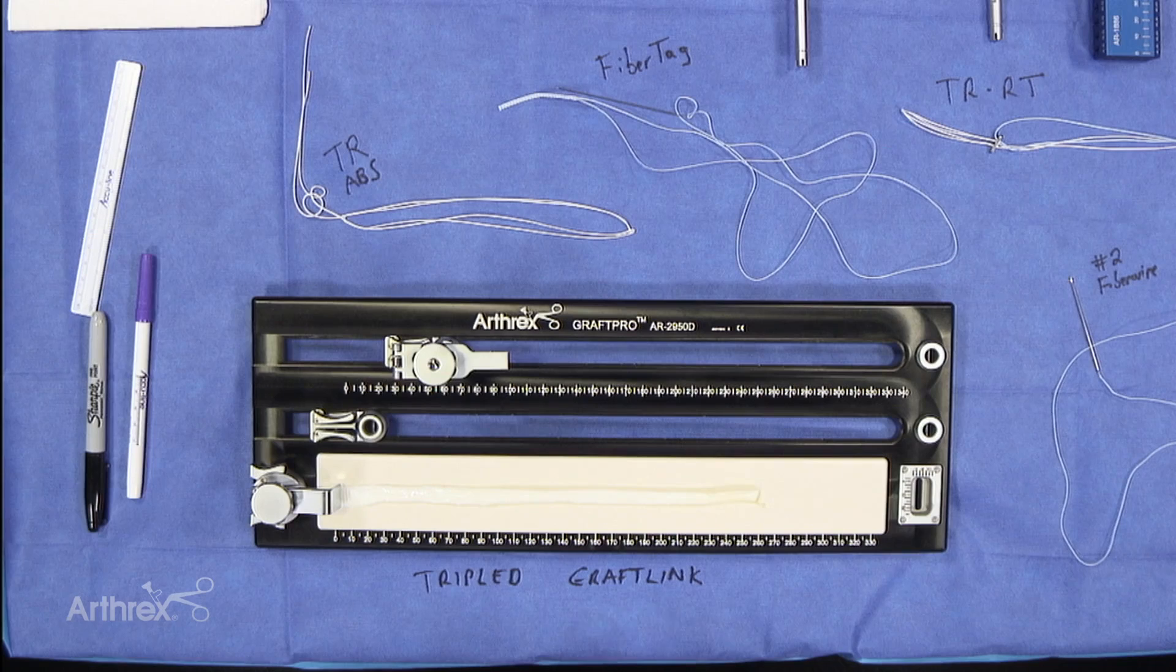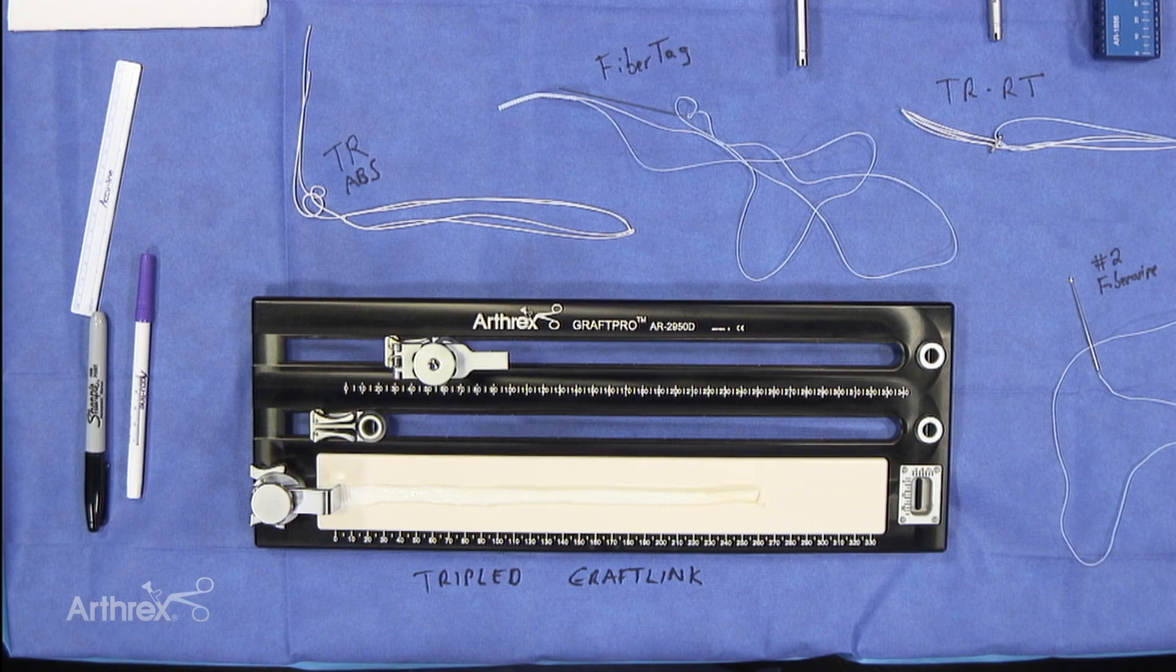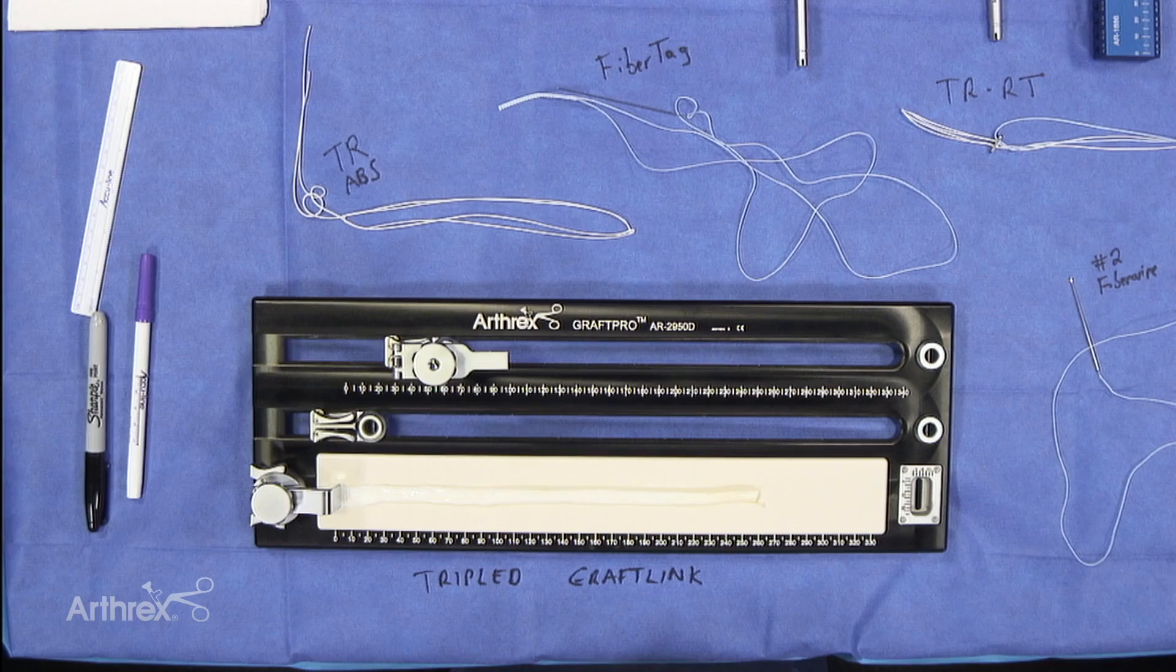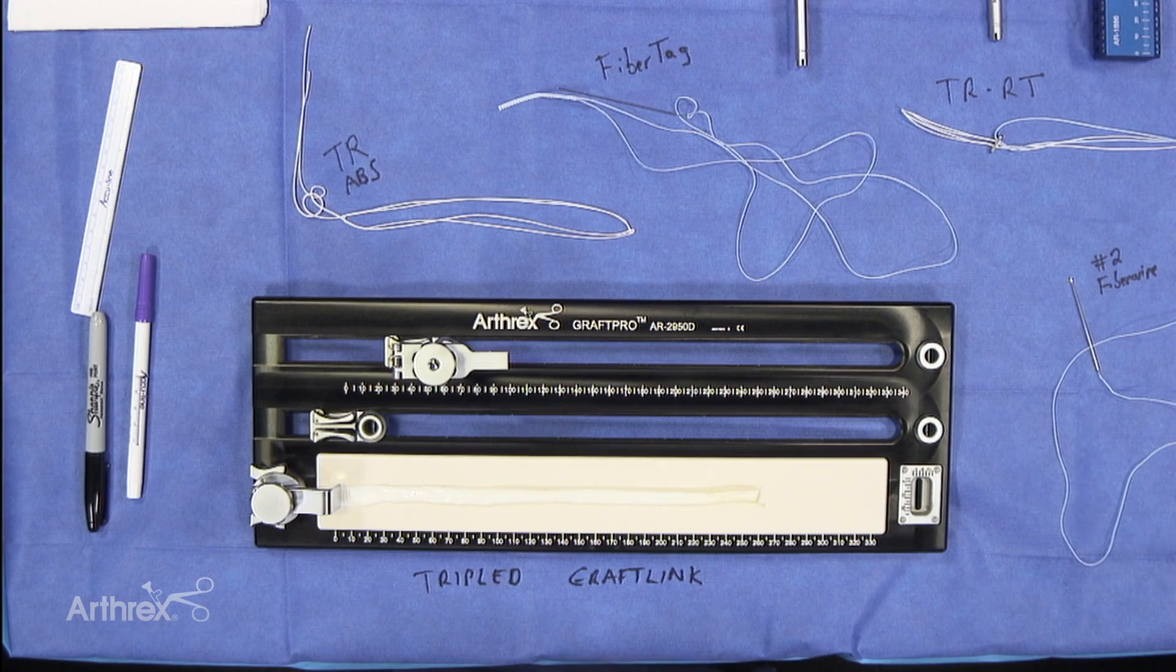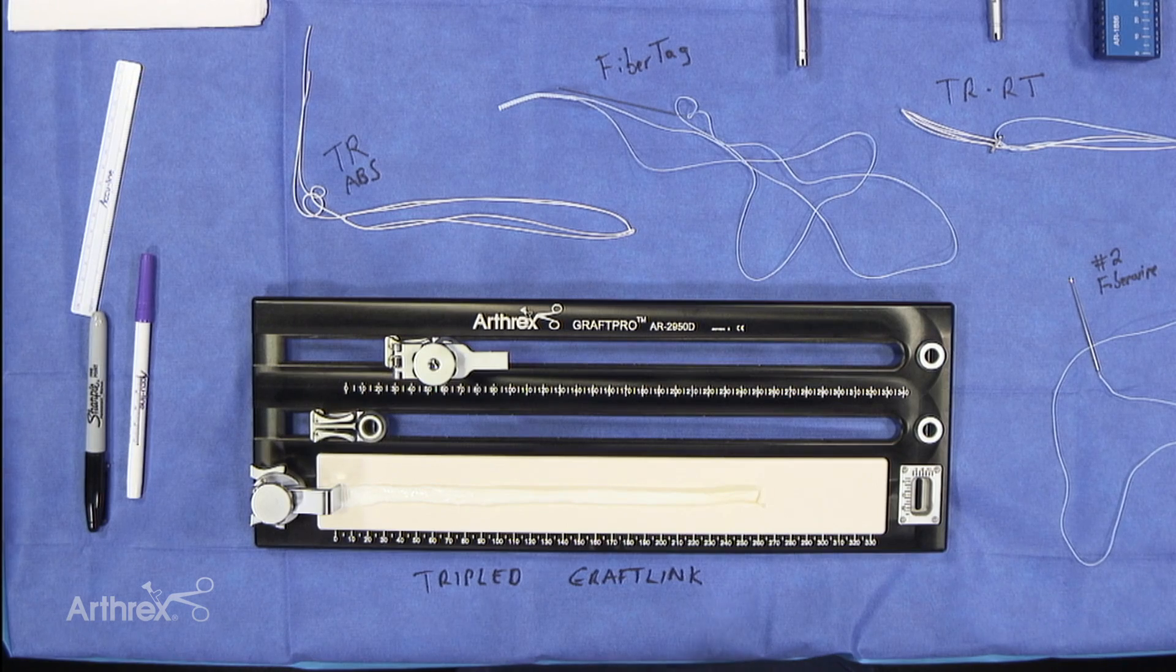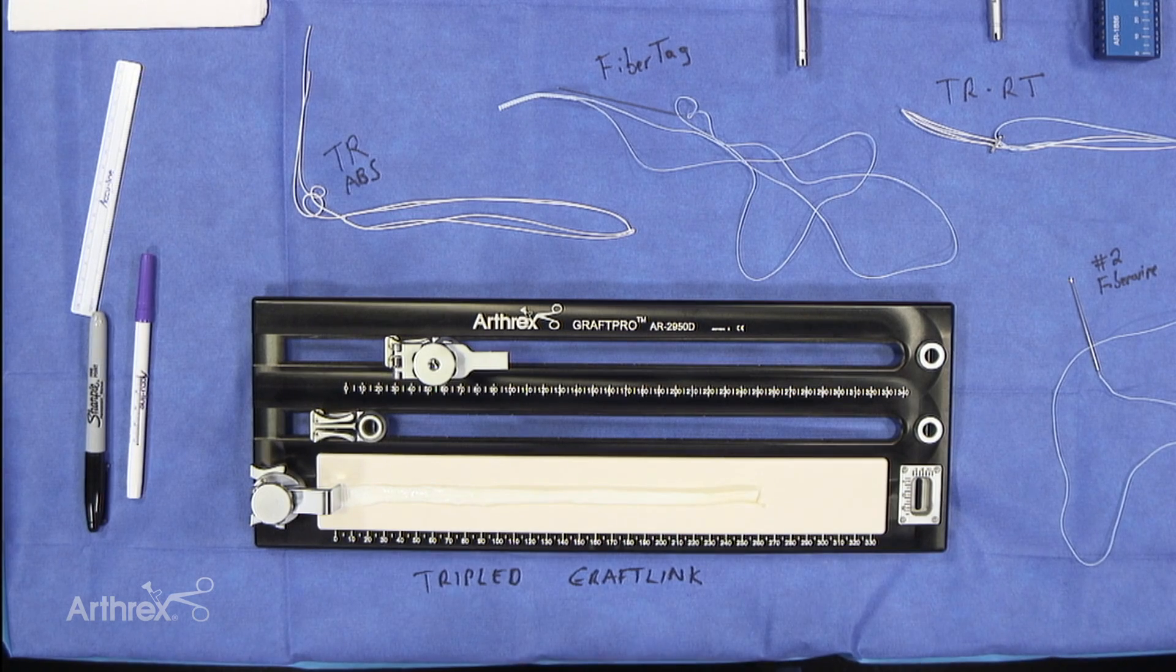Today we're going to show you how to do a tripled graft link PCL graft preparation. Often times when discussing the benefits of the PCL graft link, people ask me how do you get 35 or 36 centimeter grafts?